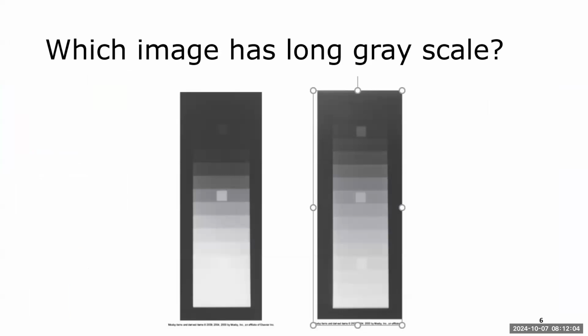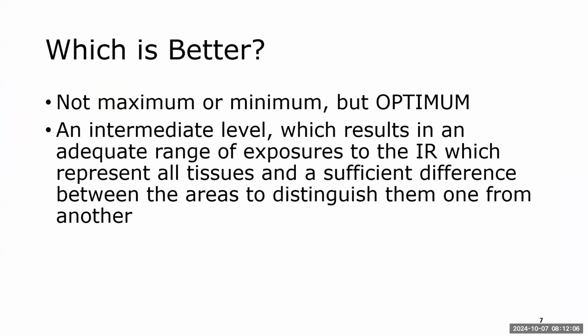All right. So, which is better? High contrast or low contrast? So there's not really a maximum or a minimum, but we think about it more as optimum. Okay, so an intermediate level, which results in an adequate range of exposures to the IR.